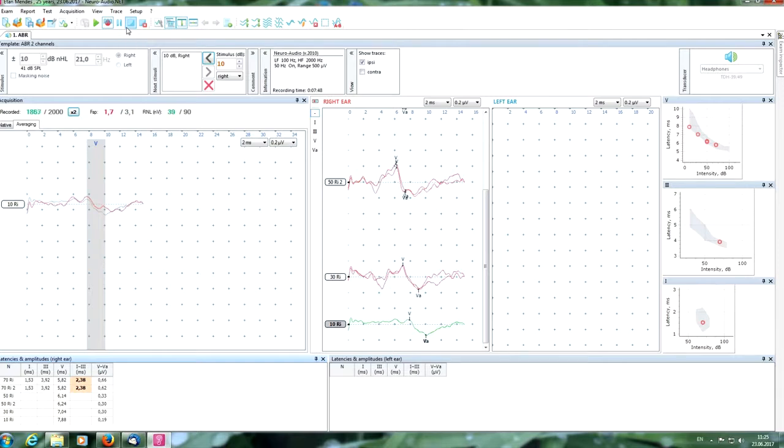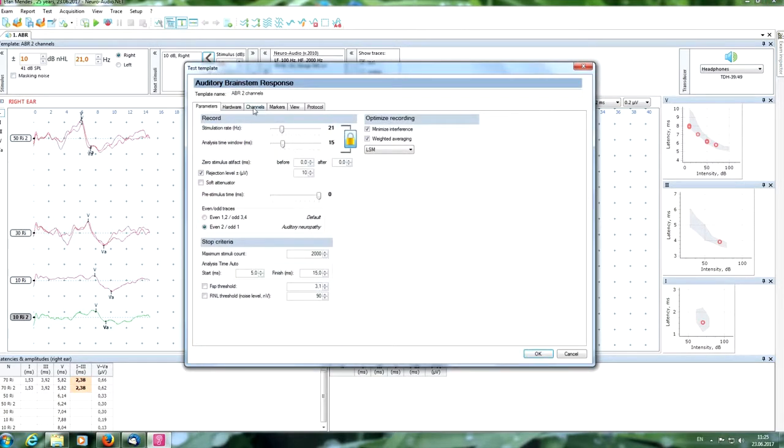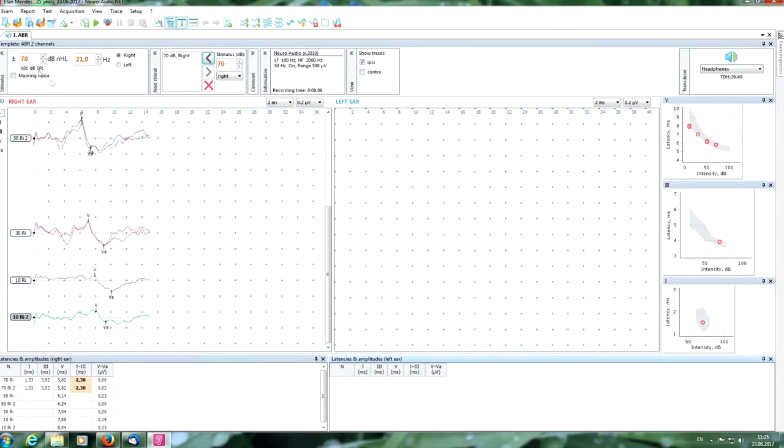increase the quantity of averaging, pushing here. For example, 4,000 or even 8,000 you can get. If you have a good response, you can stop. Now we manage the curve, inspect and put markers. Also, at near-threshold intensity, you can perform the test using another type of stimuli, for example chirp stimuli. It allows more simultaneous reaction of auditory receptors and allows us to get a higher amplitude wave.